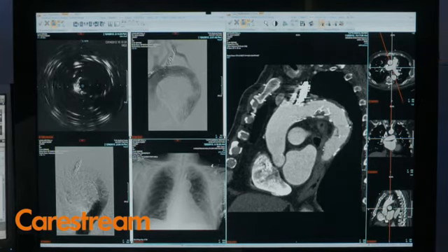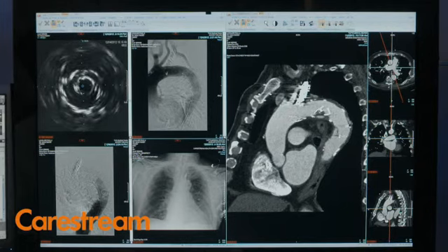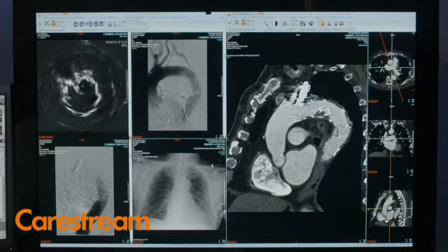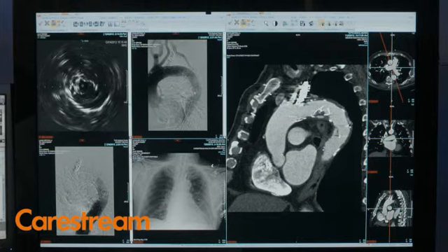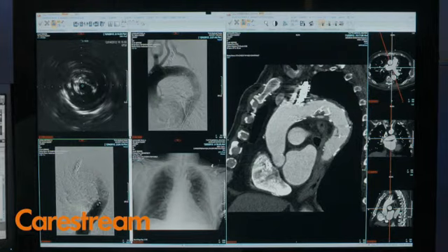And what you can see next to it and around it are different phases of an arteriogram performed during the same study that the IVUS was performed. And we're looking at this patient's thoracic aorta and how this endograft here is excluding the aneurysm. It has a little kink in the endograft, and you can actually see that over here in the IVUS. And then when we are done here, you can see that it looks much better.